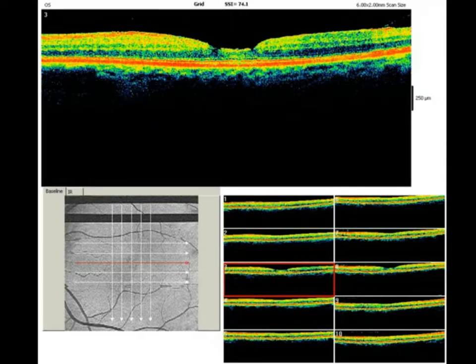So these individuals, again, were going undetected, or they had decreased best corrected visual acuity with an unexplained or questionable reason. We're adding definity to the diagnosis, and we're able to manage and monitor these patients and follow them over time to see if they actually break apart from the retina and if that vitreous actually comes apart. We now have other treatment options available as well, Jetrea or Ocriplasmin, which can actually degrade the connection between the vitreous and the macular or the retinal tissue as well.